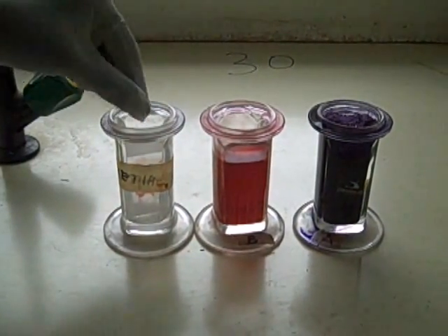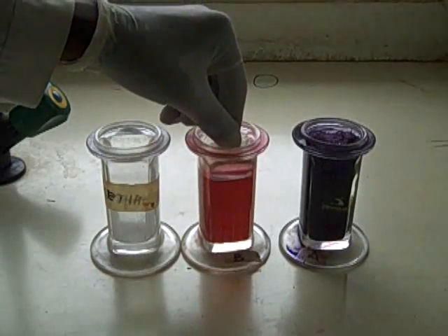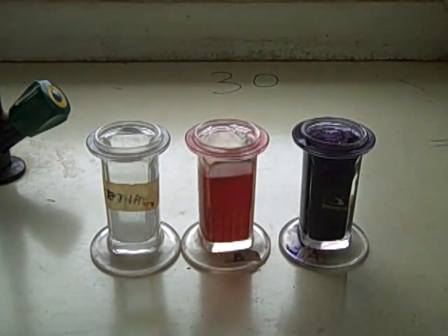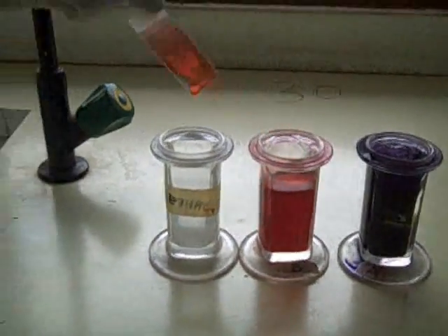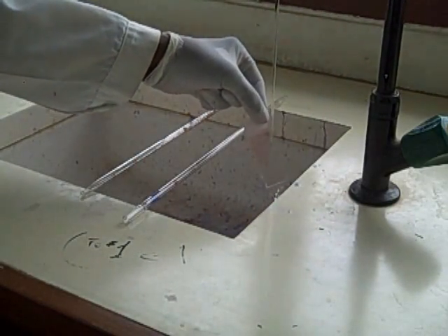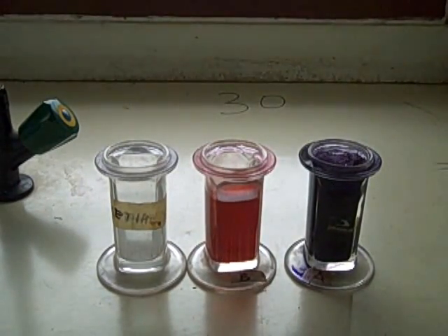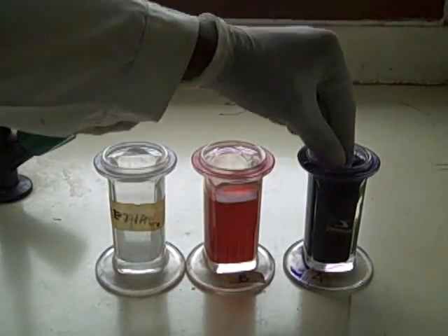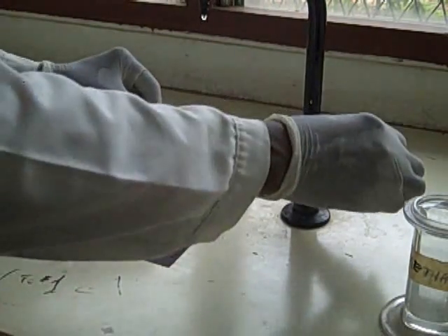Fix the thin smear in methanol for 2 seconds. Allow it to air dry and put it in Field stain B for 6 seconds, after which you wash under tap water or buffered water. Put it in Field stain A for 6 seconds, after which you wash under tap water to get rid of the excess stain. This is called reverse staining and it preserves the red cells.